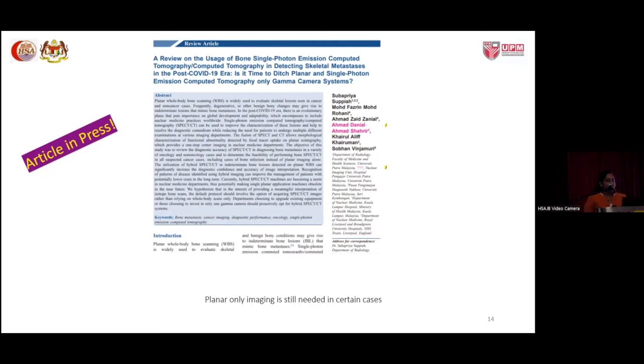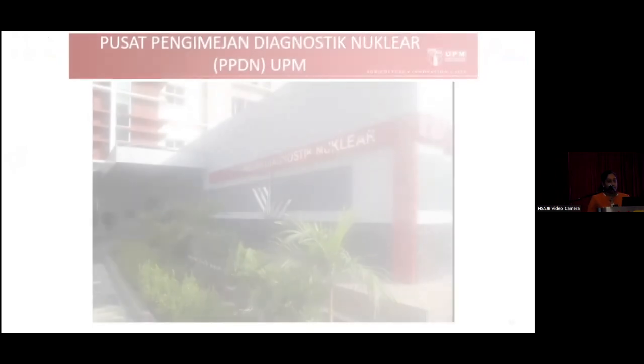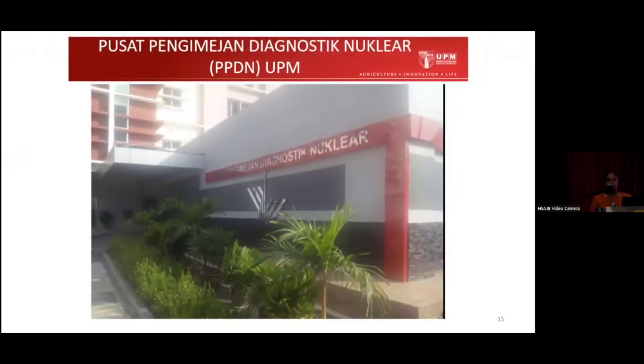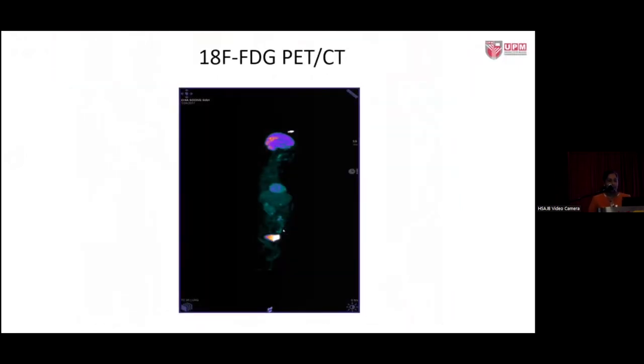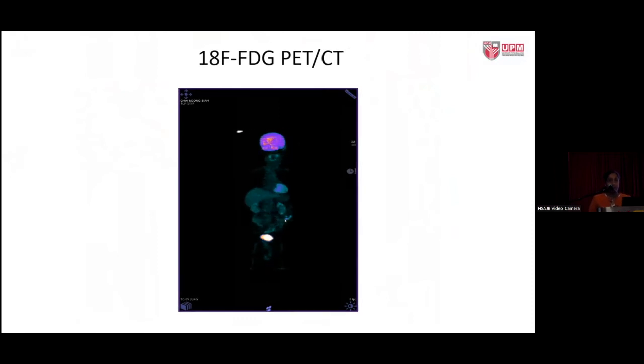Right? And then I would like to talk about PET-CT, although it's a bit out of our SPECT-CT topic. In UPM since 2010, we've had a PET-CT scanner in our research institute, and we've performed many cases related to oncology, even cardiology using rubidium, and some nuclear neurology.